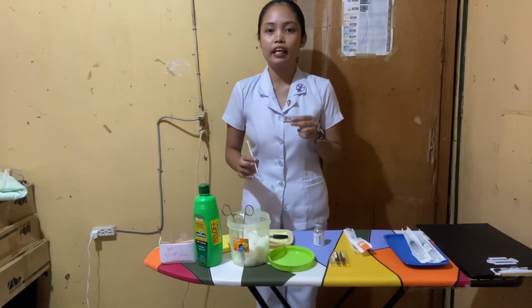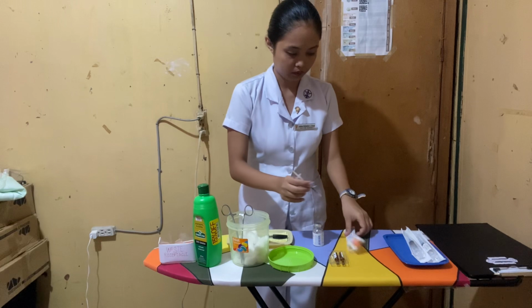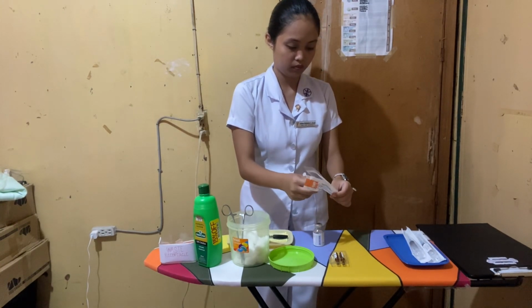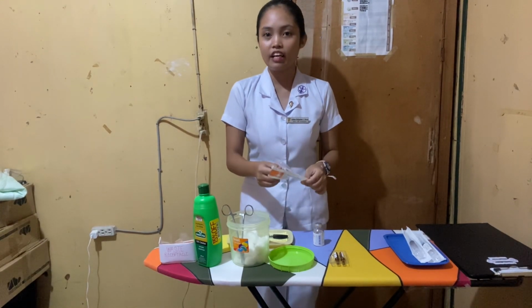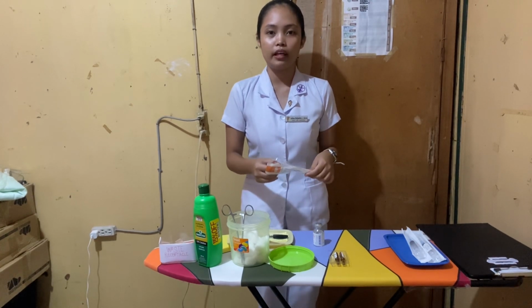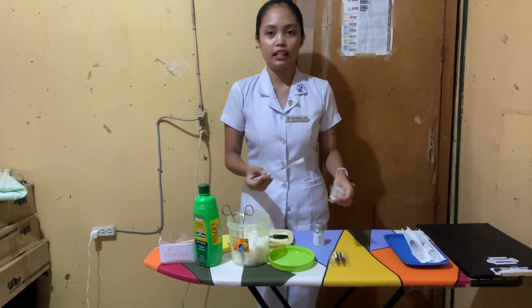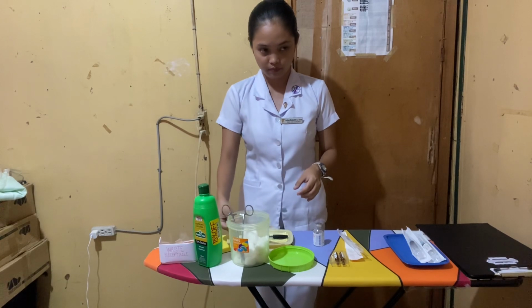Now I'm going to connect the barrel to the appropriate needle size. I'm going to place this syringe with medication into a hypodermic tray, and I'm going to write the medication ticket so that we won't forget what medication it is, the dosage, and for whom it is assigned.